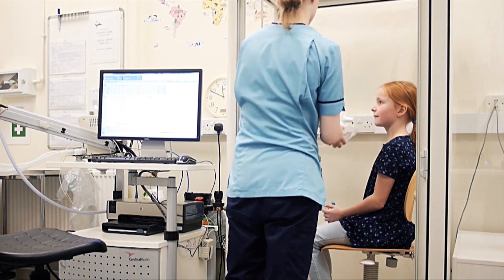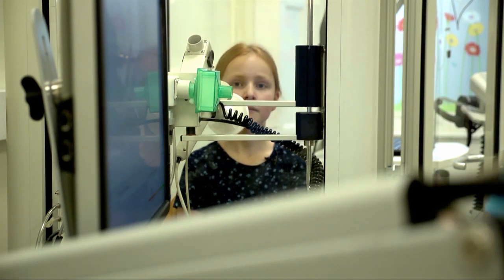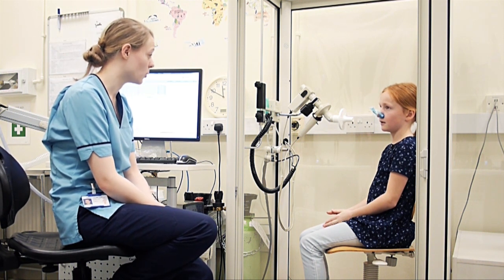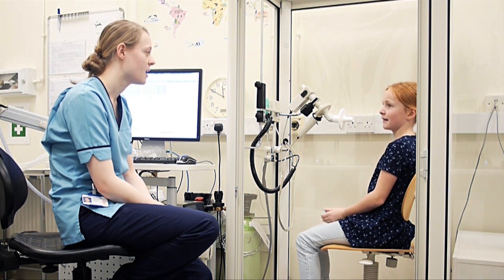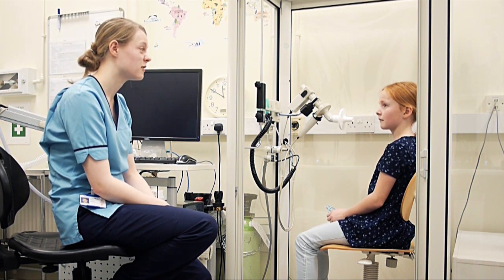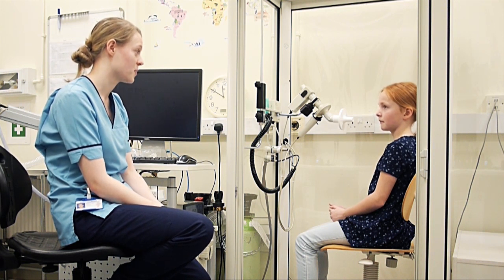We'll explain how this test works. We get you to wear your nose pegs for this test as well, and we also need you to pop your hands up onto your cheeks — that's because there's a shutter in here and when the shutter closes we don't want your cheeks to move around too much. First, I'll get you to just sit in the box and not do anything for about a minute, because the box gets a wee bit warmer when you go in and we want to allow it time to settle. Then put on your nose pegs and start with nice normal breathing. Once your breathing is steady I'll tell you the shutter is going to close, and I want you to carry on breathing normally against the shutter for about two breaths. Then the shutter will lift and you blow all the way out to empty your lungs, then a really big breath all the way in, and blow all the way out again to empty your lungs.